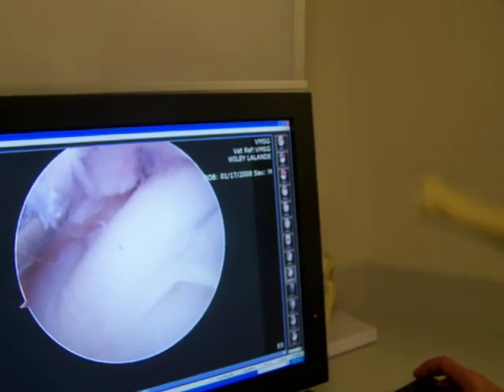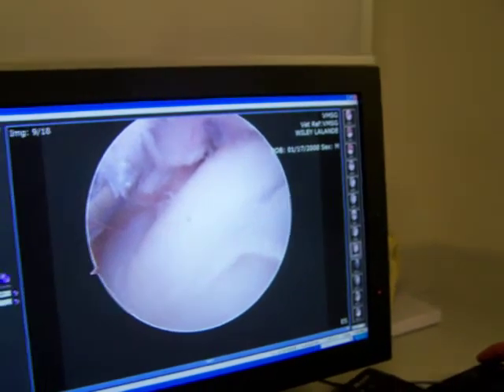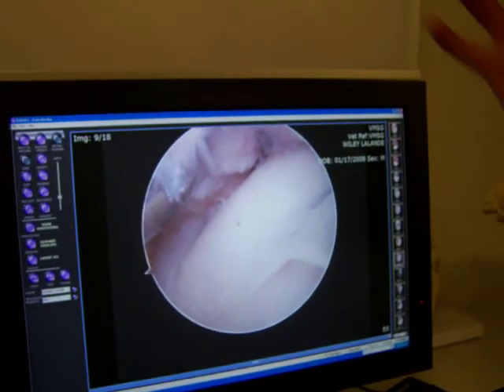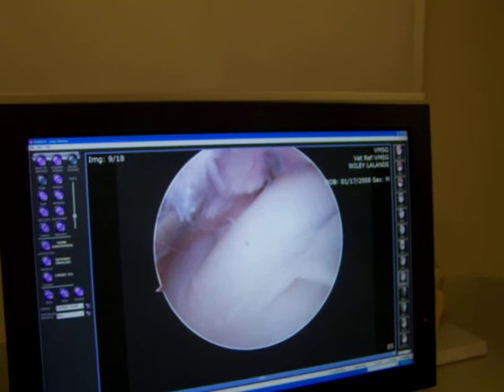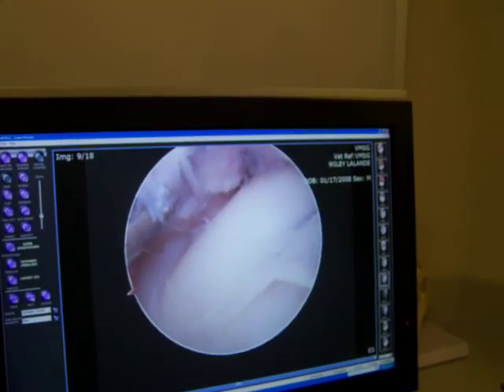If it's bigger like this, it means I can get it out completely rather than it disintegrating and being left as flotsam and jetsam floating through the joint, because you can't get to all the areas of the joint without re-prepping and rolling over — it goes on and on. Did you find many fragments in there? No, no fragments.